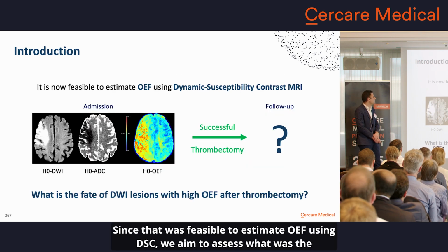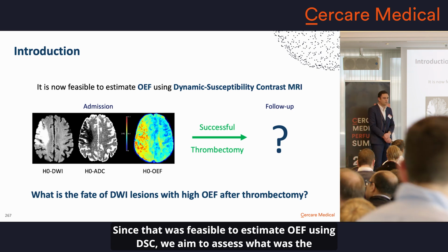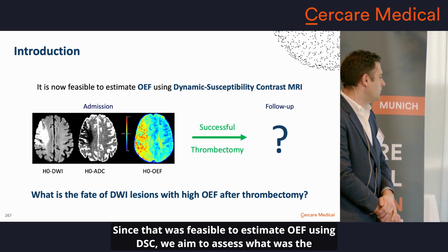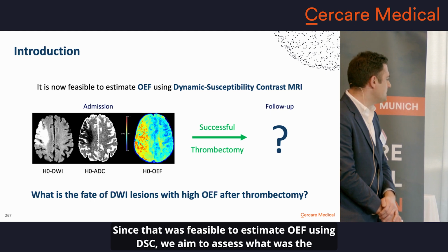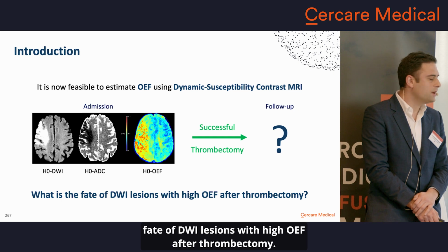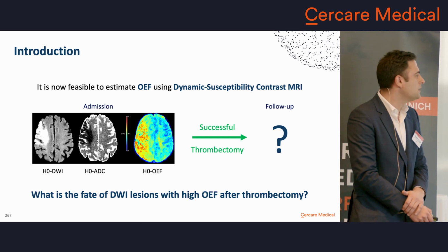Since it was feasible to estimate OEF using DSC, we aimed to assess what was the fate of DWI lesions with increased OEF after thrombectomy.